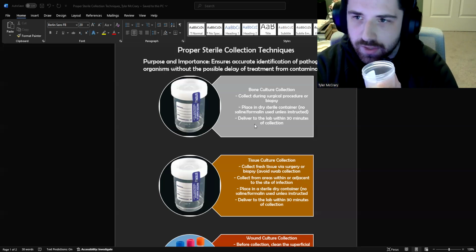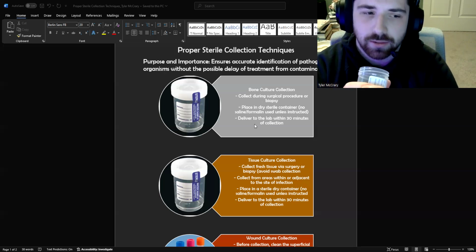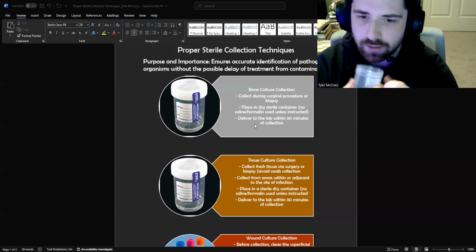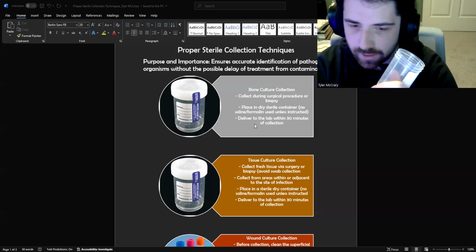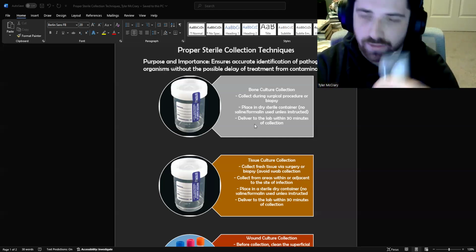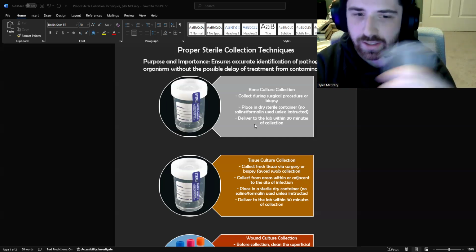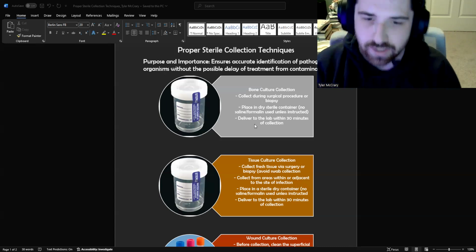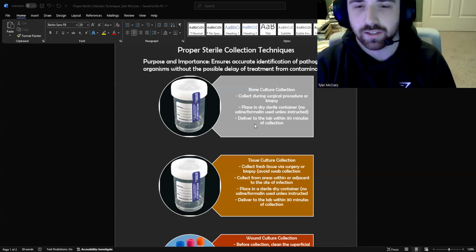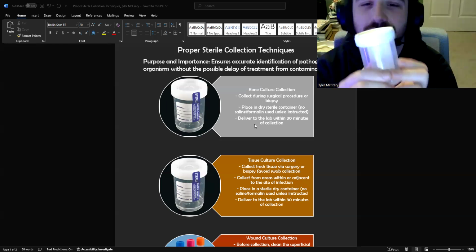We do put some tissue specimens in formalin, but that's mainly for pathology to review. But when we're receiving it in the lab to create a tissue culture, we receive it in one of these containers as just a toe in a container. Once it gets to the lab, we have our techniques to keep it sterile when we cut off a piece of the toe and grind it and get it down to where it can be plated. But for standard collection, we also can't necessarily reject these, because if it's a toe, you can't really recollect a toe or a different toe. So we just keep it in these containers.